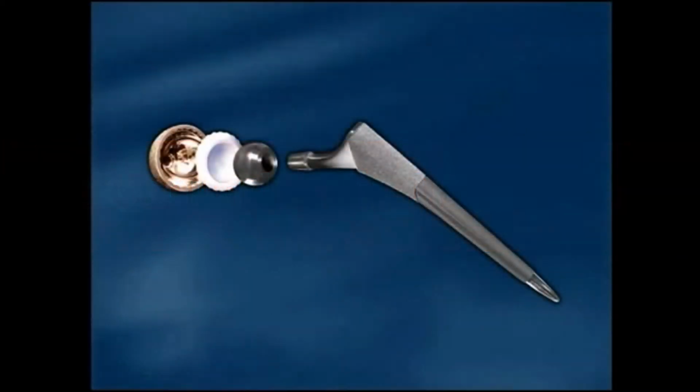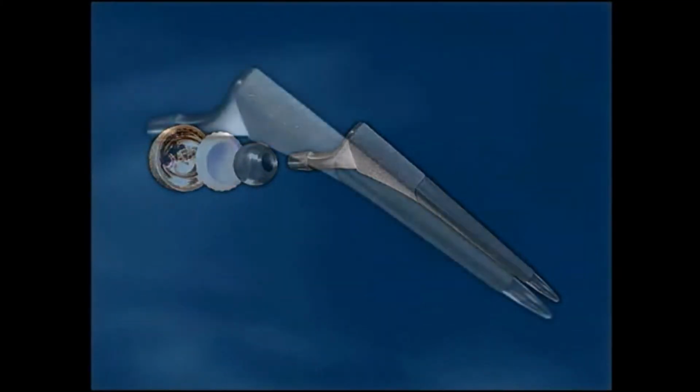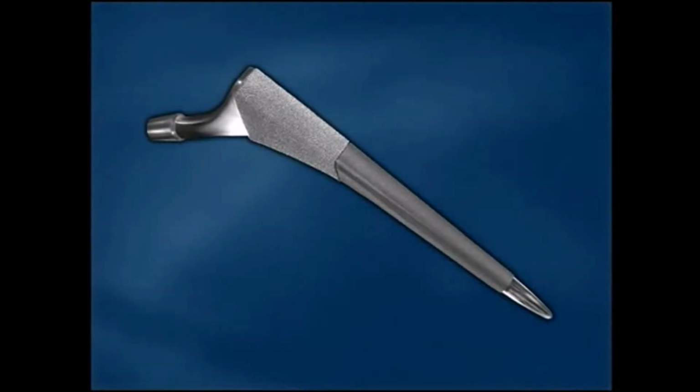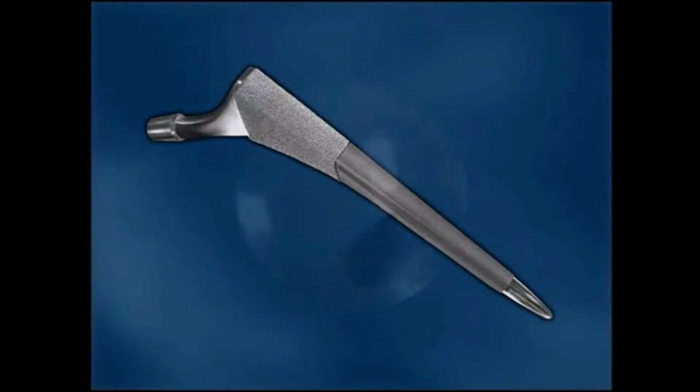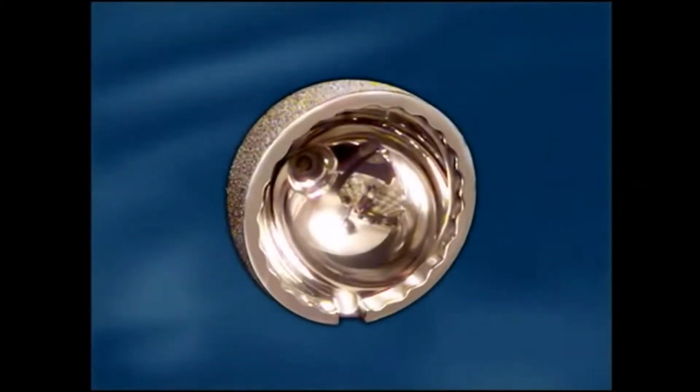In total hip replacement, the prosthesis or implant is made of 4 components. The femoral stem is made out of metal, such as titanium, and is implanted down the shaft of the thigh bone or femur. The ball or femoral head is attached to the stem and is designed to replace the arthritic femoral head. The third part, or acetabular component, is a metal shell with a plastic inner socket liner. Each of these components is the result of years of engineering, research, and testing.